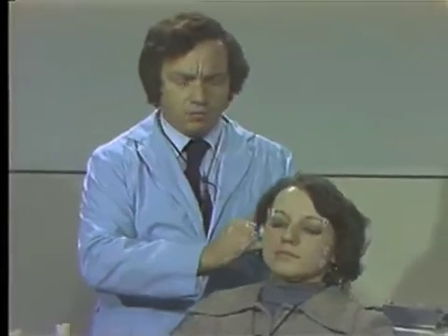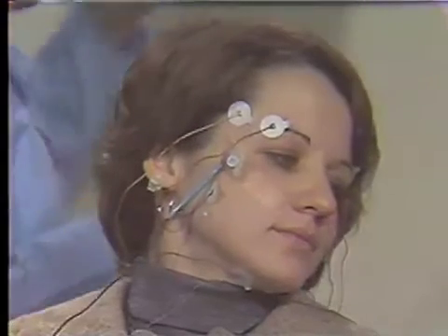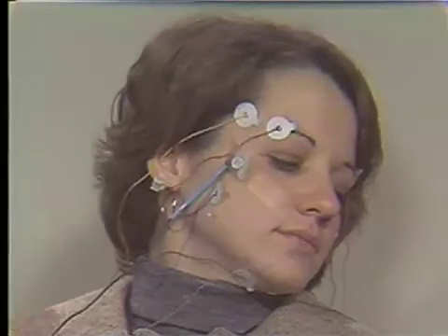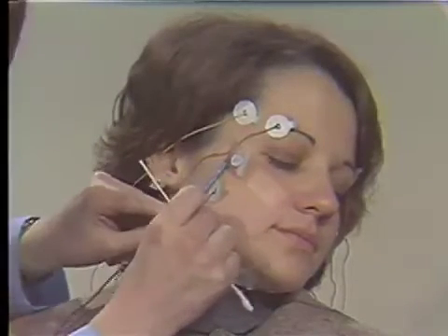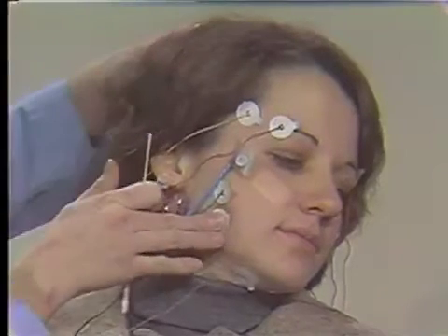At this stage we'll ask Norma to place the remaining electrodes on for you to see what electrode placement involves. Would you just show this placement, Norma? The area of the skin is first cleared with alcohol and any makeup or loose scales are removed. This has already been done. Next, some conduction paste is placed on the spot. A silver electrode is now placed on top of this conduction paste and stuck with an adhesive.